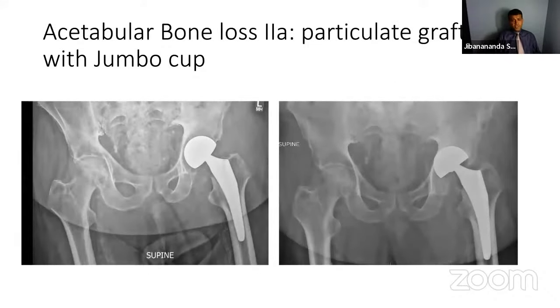This patient, actually one of my nurses' father-in-law, had a femoral neck fracture and a hemiarthroplasty, and has a rapid erosion of the acetabulum. He was lengthened a little bit. I guess the pressure from the increase in length, as well as the previous soft or arthritic acetabulum, led to rapid erosion. He was in severe pain in a year and was completely wheelchair bound.